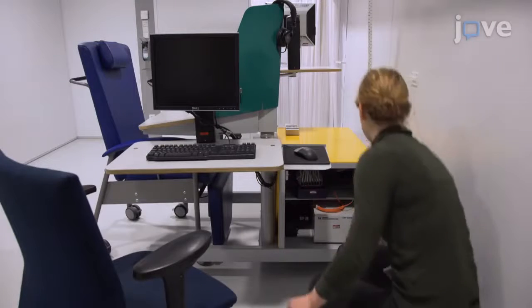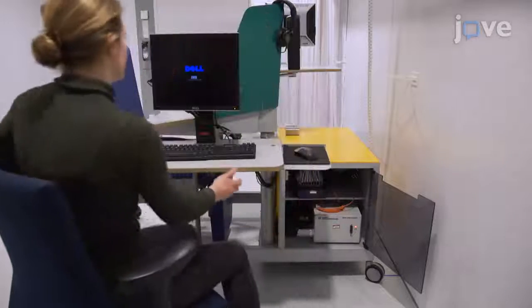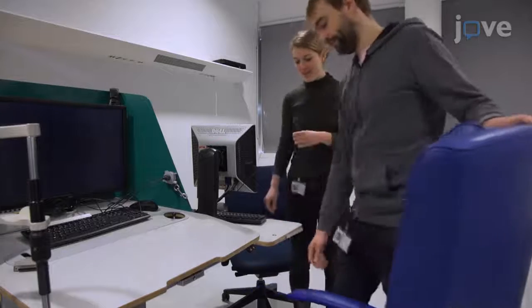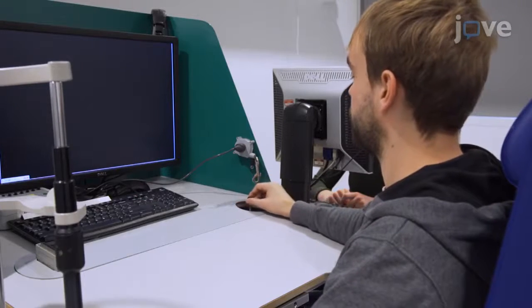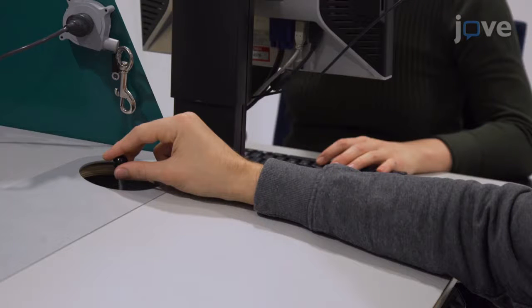To begin this procedure, switch on the power of the test battery computer and turn on the computer and screens. Then, seat the subject in front of the computer screen and joystick. Confirm the preferred hand of the subject and adjust the joystick accordingly. Instruct the subject to hold the joystick as a pen, with the arm resting on the table.